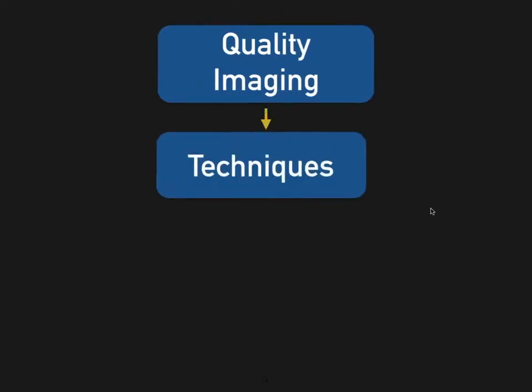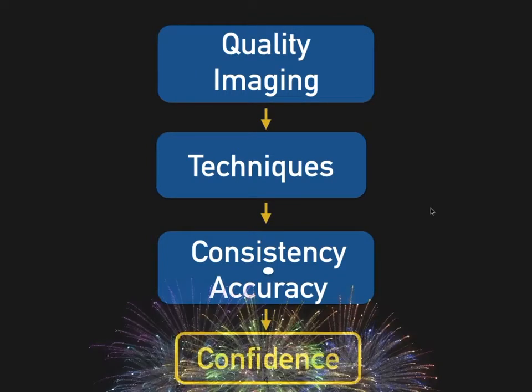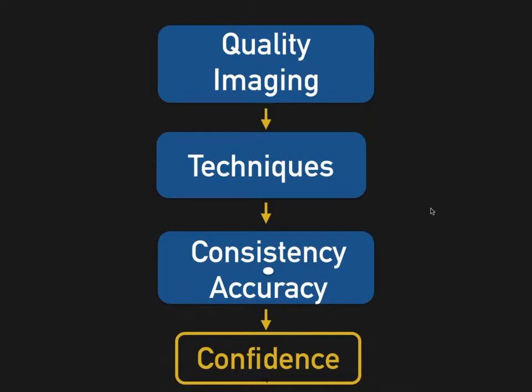On the other hand, excellent quality imaging is developed from learning and practicing the proper techniques, which leads to everyday consistency and accuracy in your study and building confidence as a sonographer or an imaging specialist.